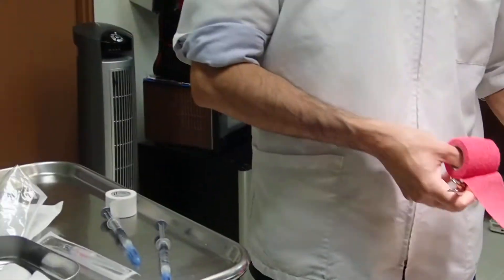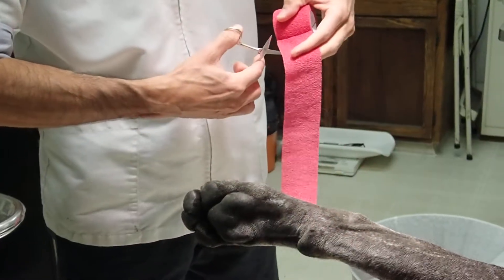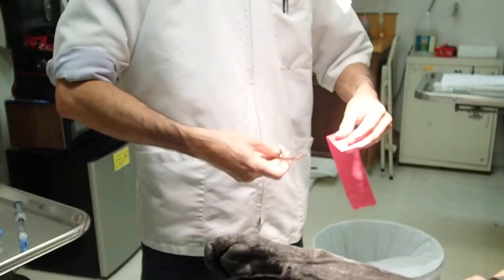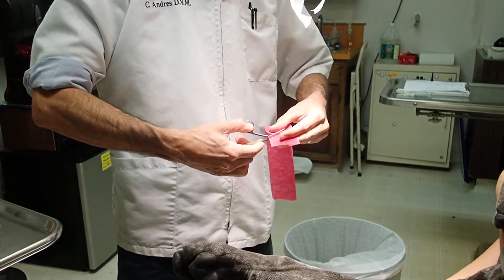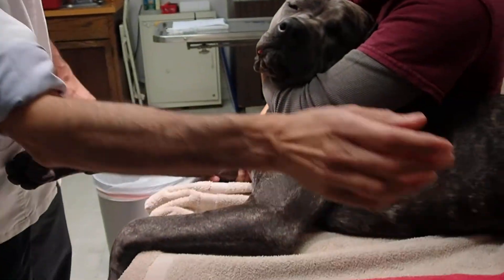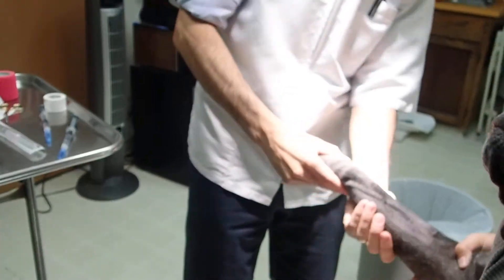I do cut a piece of vet wrap that's about one and a half times the circumference of the limb, approximate. On one of the ends, I'll leave about two or three centimeters and cut it right down to about three-fourths the length — we'll use this at the very end. So I'm going to set this aside, and now we're ready to start our IV catheterization.